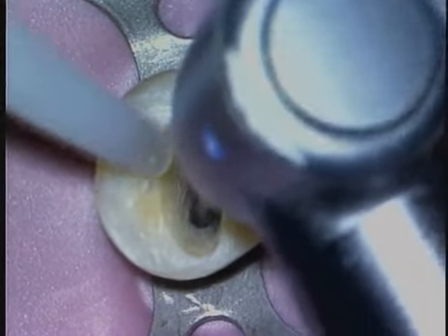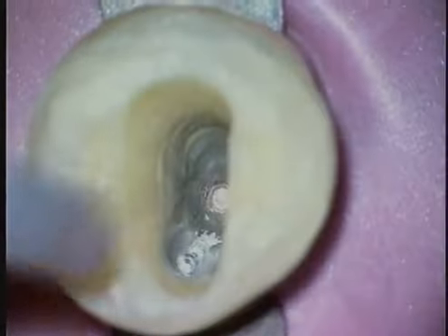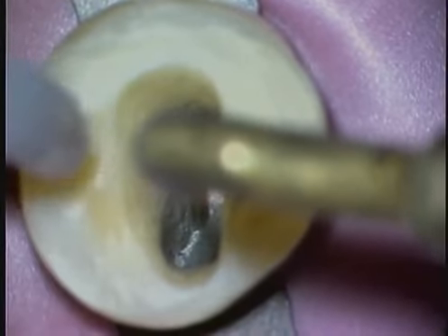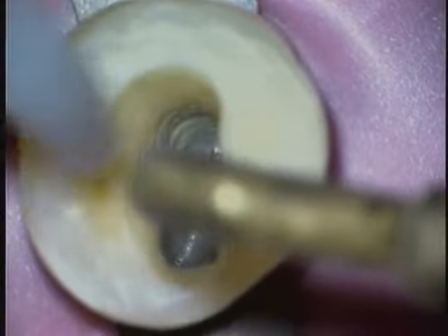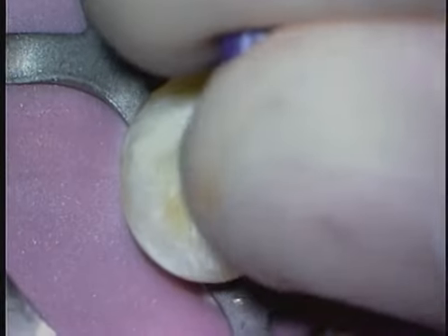We've talked several times during this tape about the importance of facing off orifices with Gates Glidden drills. This is a really important secret because a lot of times once we fill these chambers with a chelator, our visibility is now obstructed. So now we can slide instruments down smooth axial walls into these faced-off orifices, and it helps negotiate the canals. Ultrasonics can chase out the isthmus or related anastomosing between orifices, and again with a faced-off orifice we can pretty easily slide into this system.